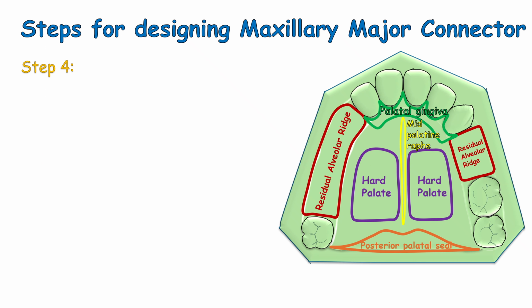Step 4, choose the appropriate connector. This is based on these 4 factors. First, mouth comfort. There should be a minimum bulk, and it should also avoid interference during speaking.